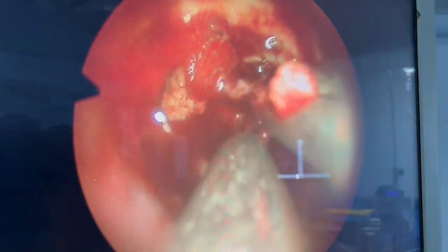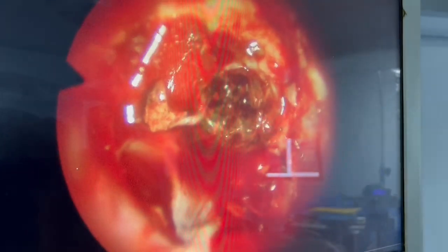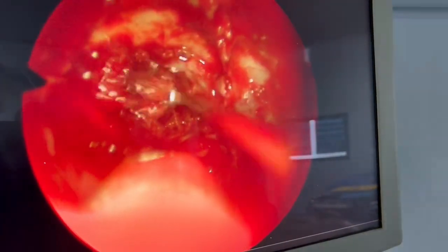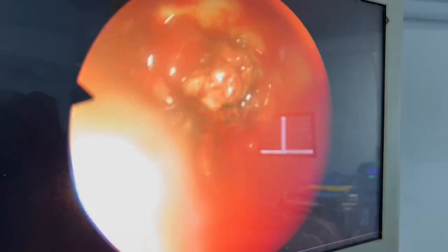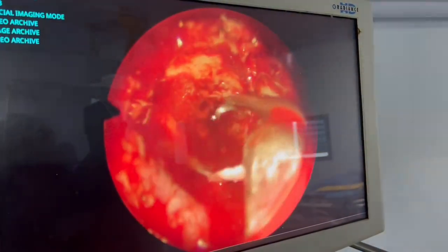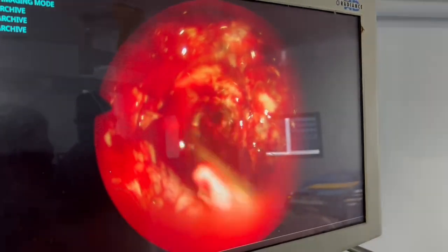Early steroid therapy and urgent decompression are key to preventing permanent nerve deficit. This endoscopic transsphenoidal approach offers better visualization, minimal morbidity and faster recovery compared to the microscopic approach. After removing the hematoma from the pituitary fossa, you can see the real tumor coming out, a yellowish tumor coming out from the fossa. After removing this tumor and completely clearing the sella, you have to plan for reconstruction.